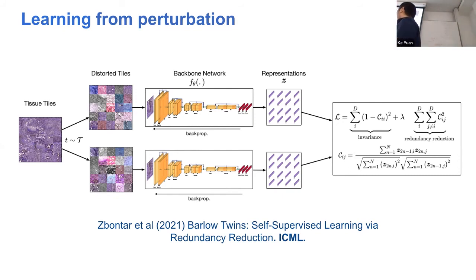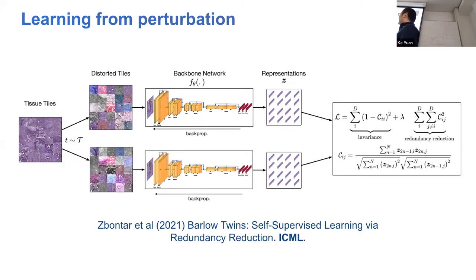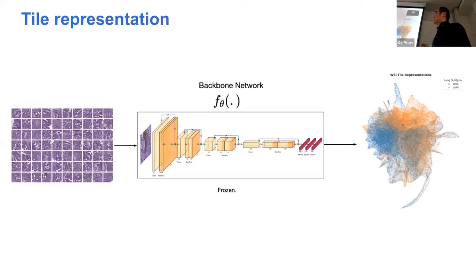Of course, you can also try to use SimCLR or other contrastive approaches. We also tested that. We can show you some simple comparison. But the point is that I guess you can use any self-supervised learning network here to get some representation you get from the image.